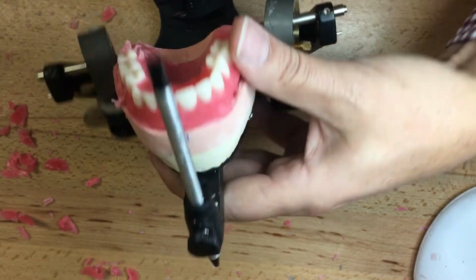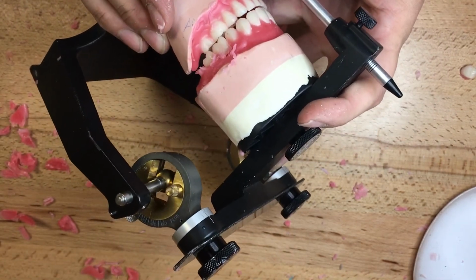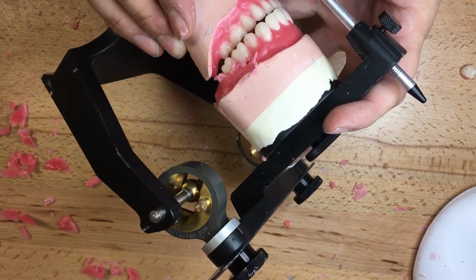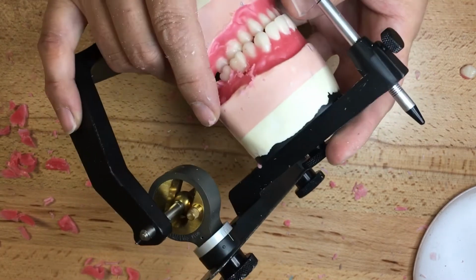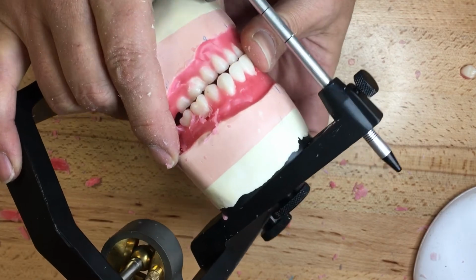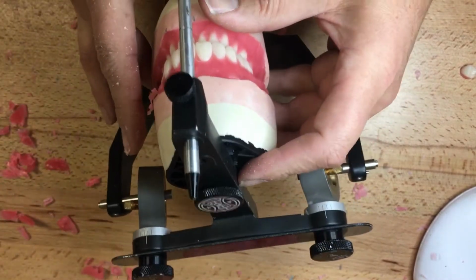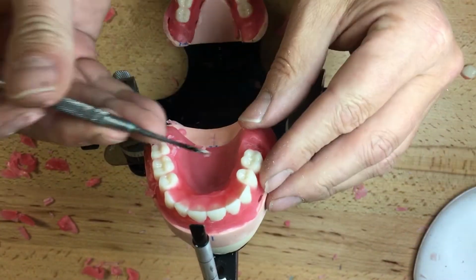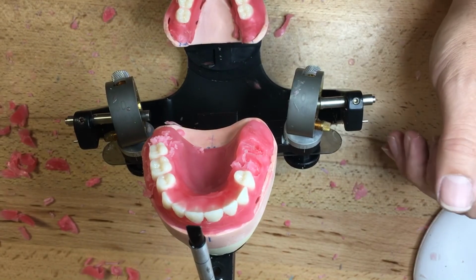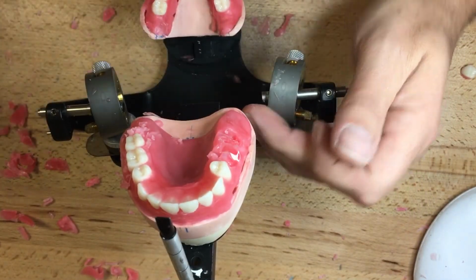Number 7, centric occlusion, protrusive contacts, balancing contacts, protrusive contacts, balancing contacts. Not quite 100% till I change this number 6 on the other side was prematurely occluding with the lower 6. I did not change this one.